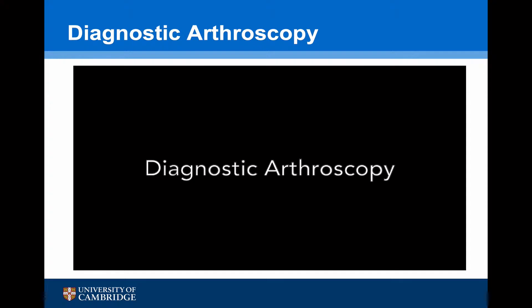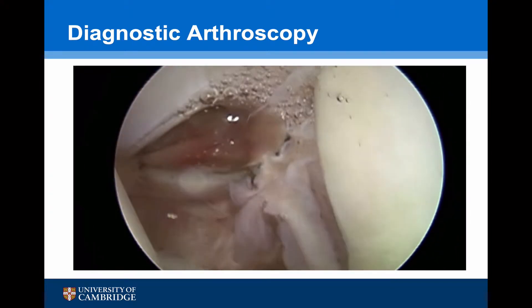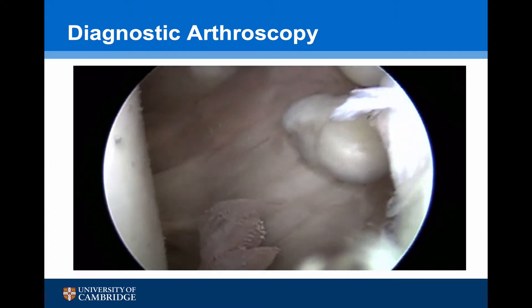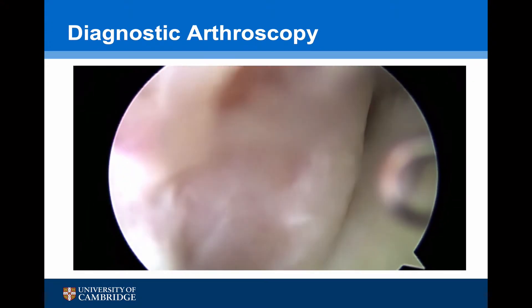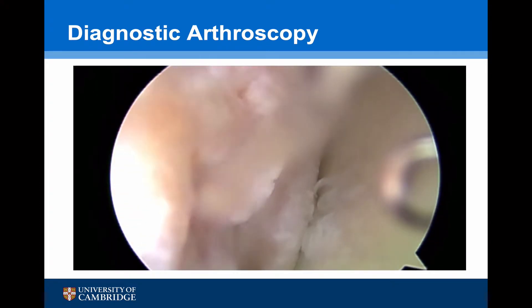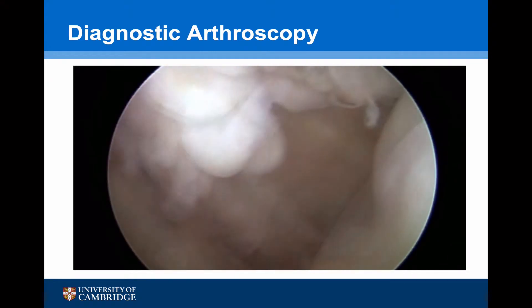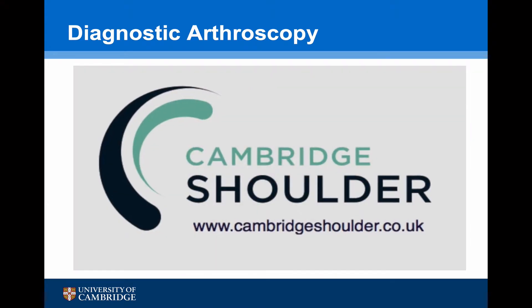This is a diagnostic arthroscopy of a 23-year-old male's left shoulder who is having recurrent instability. We can see that he has a Bankart tear anteriorly. As we come inferiorly, we can see there is some labral damage and possible damage to the capsule, so it's important to look for a Hagl lesion. The arm is brought into abduction and external rotation; we can see the Hill-Sachs lesion, and this doesn't engage in the physiological position. From the anterior portal, we can now see evidence of an ALPSA lesion — the capsule is healed medially — and there's no evidence of a Hagl lesion as we internally rotate the shoulder.